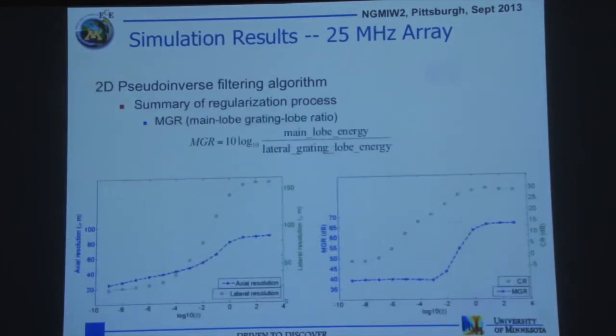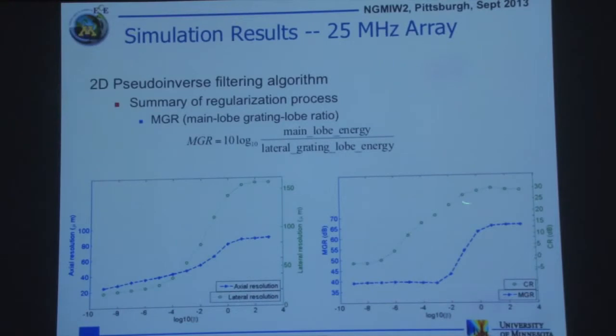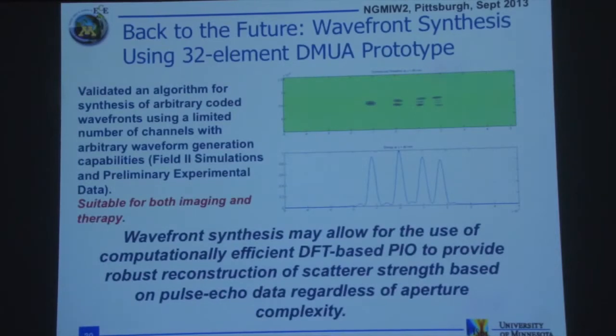This is just further analysis. I would like to show this very nice result for us, that the regularization operator is very well behaved. If you have an ultrasound machine, the operator could just slide a knob and see what is the best contrast and the best resolution. All the resolution, axial and lateral, behaves in a monotonic way. Similarly, the CR and what we call MGR, which is the ratio between the main lobe and the grating lobe, seem to correspond to each other in terms of degradation of the image. So again, this was a satisfying result.